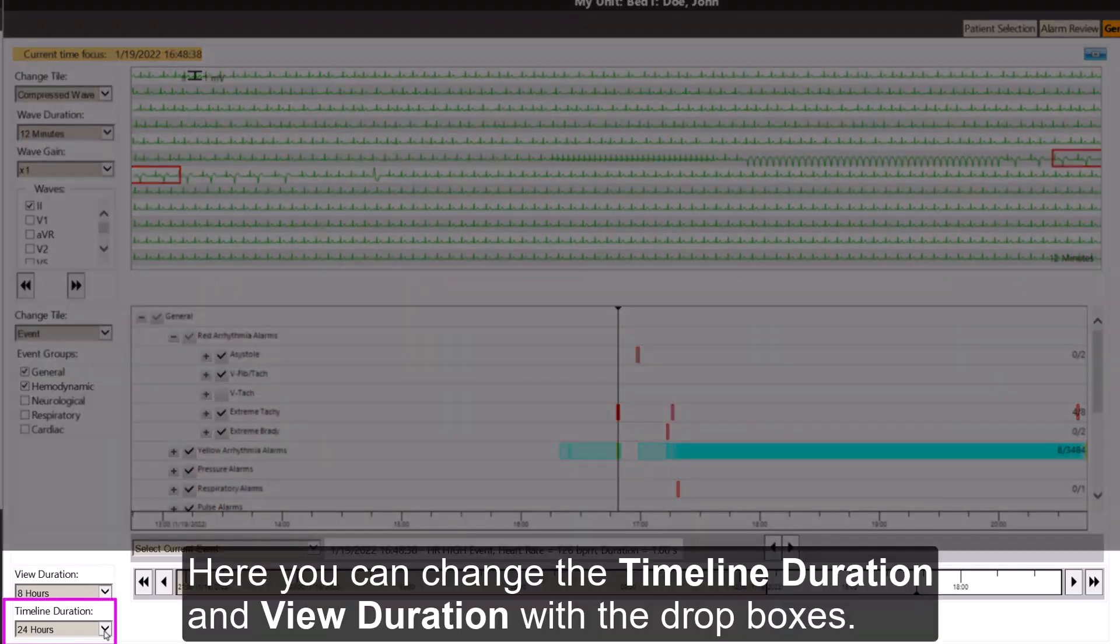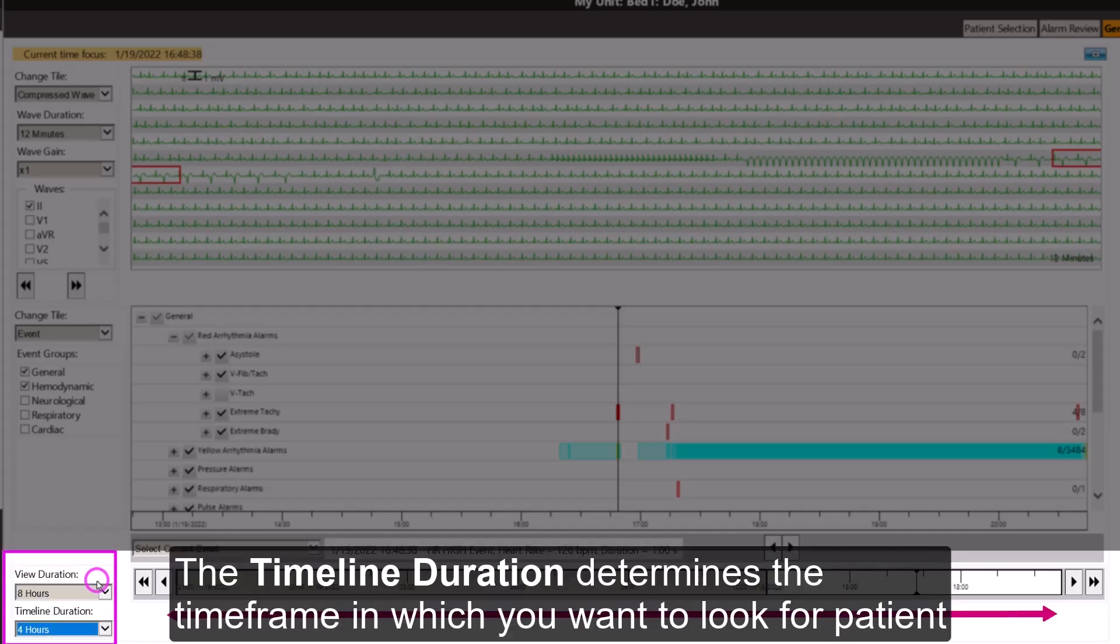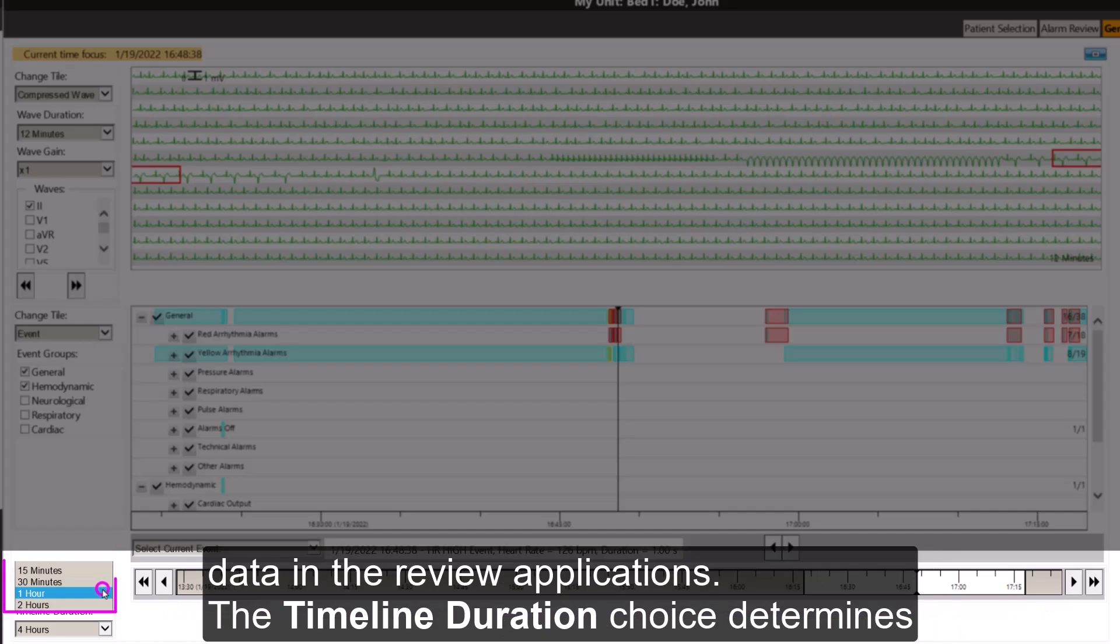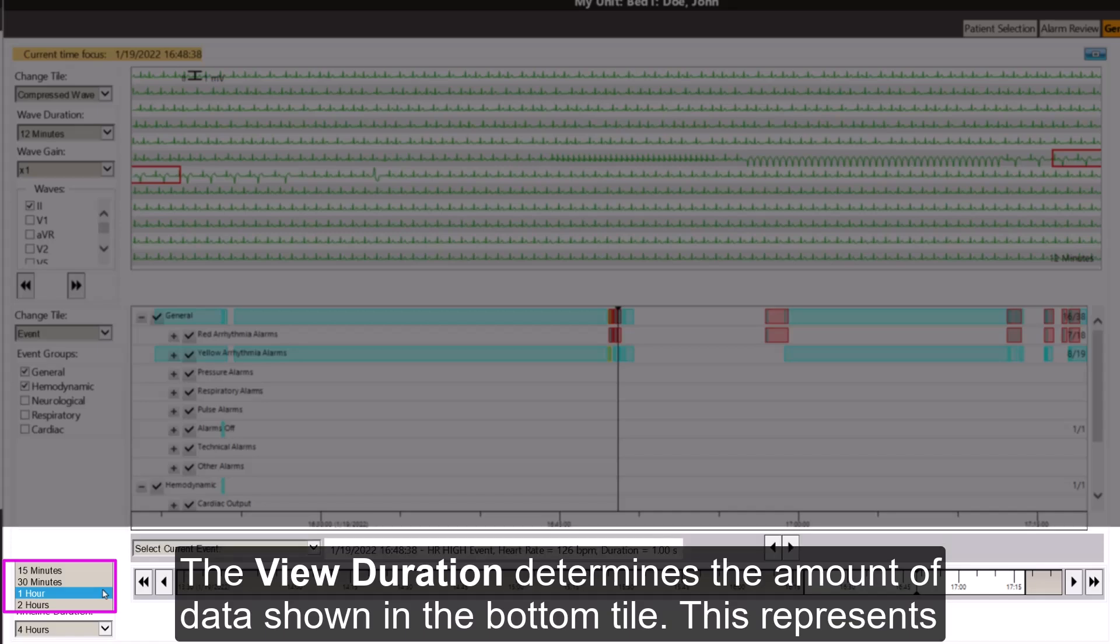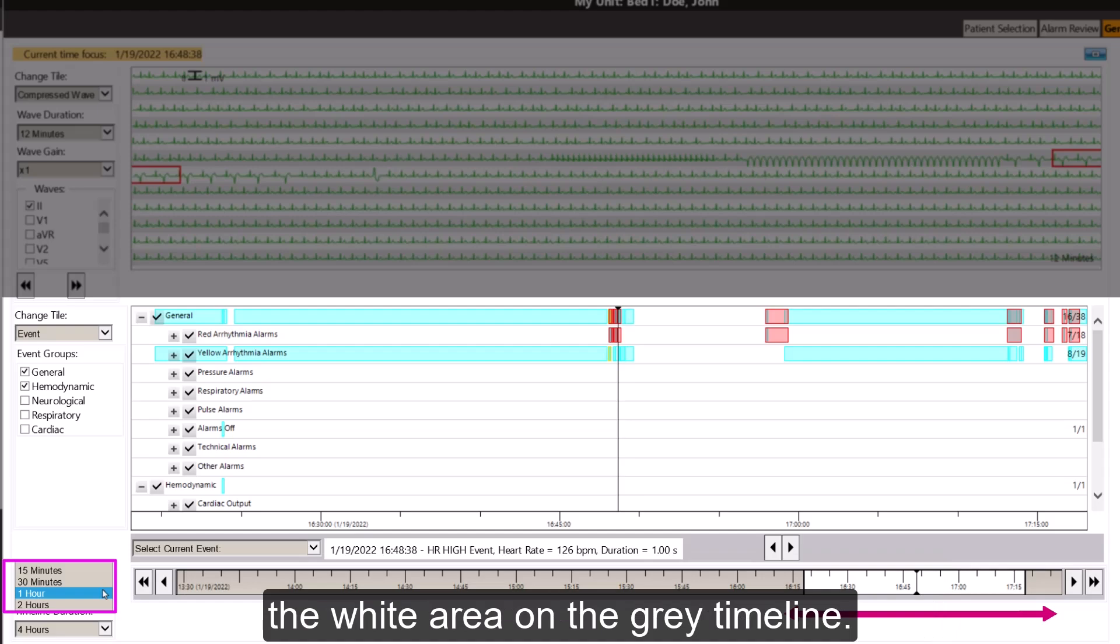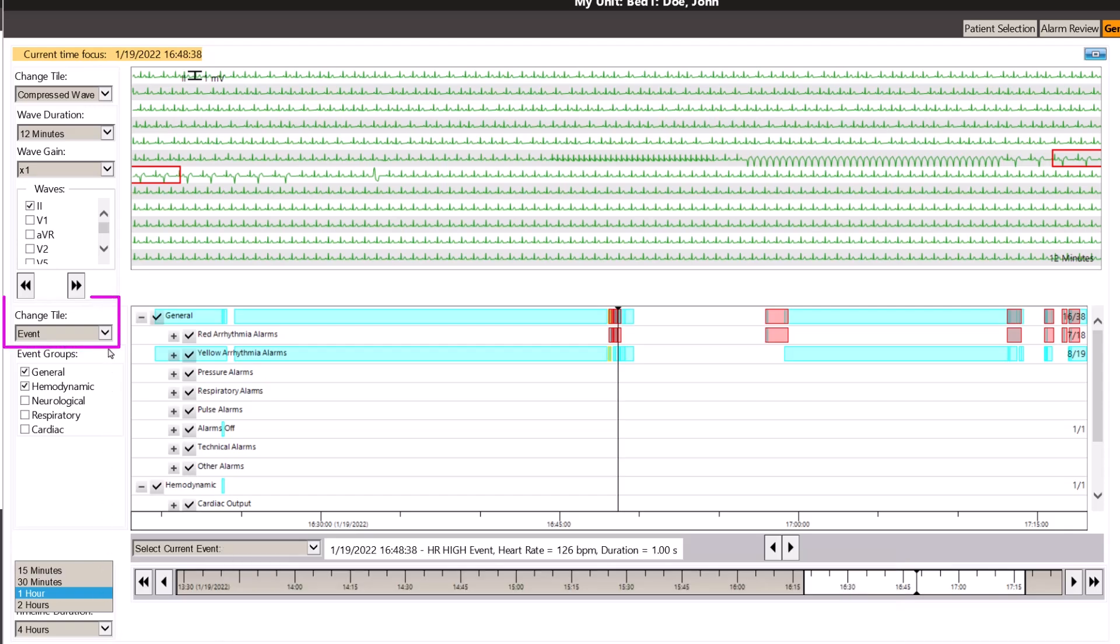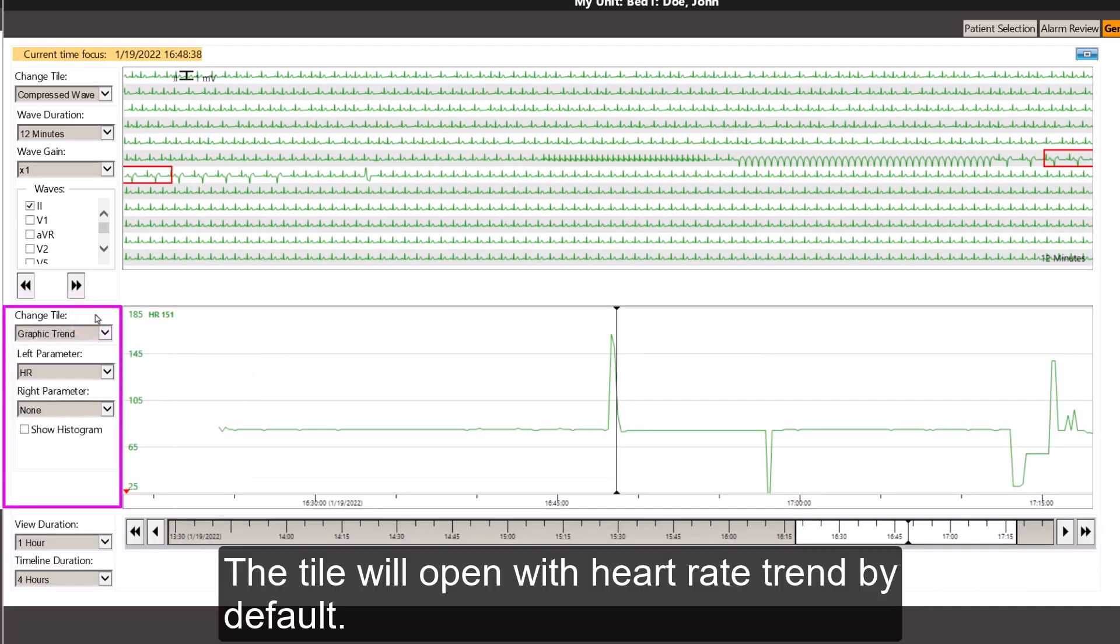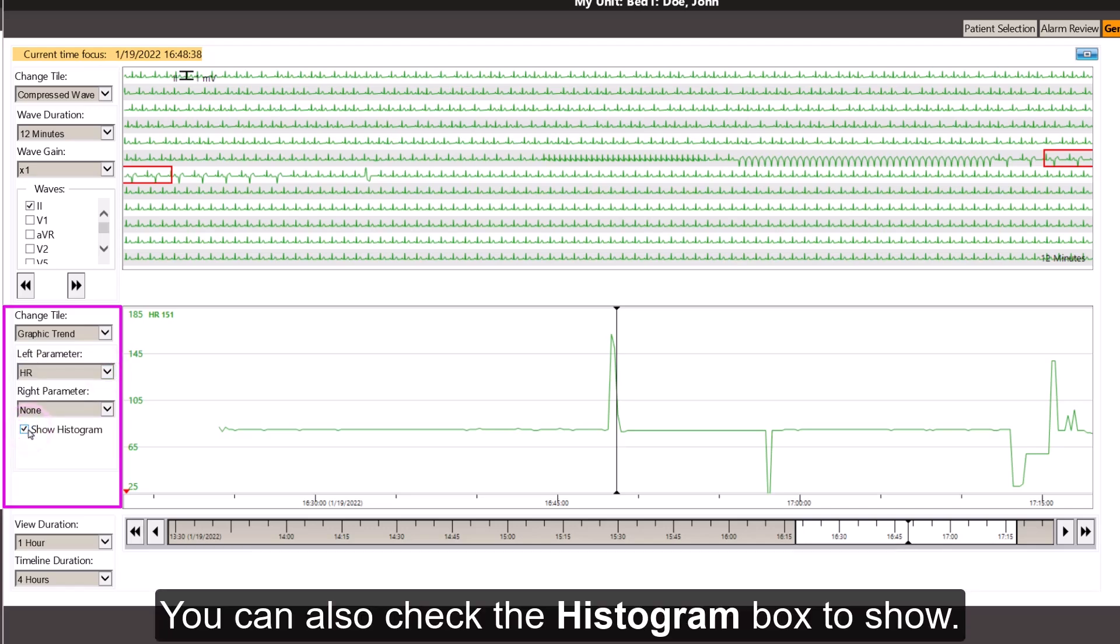Here, you can change the timeline duration and view duration with the drop boxes. The timeline duration determines the time frame in which you want to look for patient data in the review applications. The timeline duration choice determines what the view duration can be. The view duration determines the amount of data shown in the bottom tile. This represents the white area on the grey timeline. This view duration is also helpful when looking at the graphic trend tile. Select the Change Tile drop-down box to change the graphic trend. The tile will open with the heart rate trend by default. You can select a different parameter from the left parameter drop-down box. You can also check the histogram box to show.